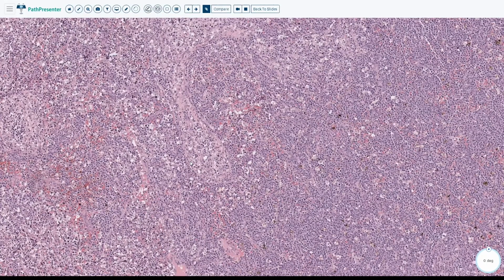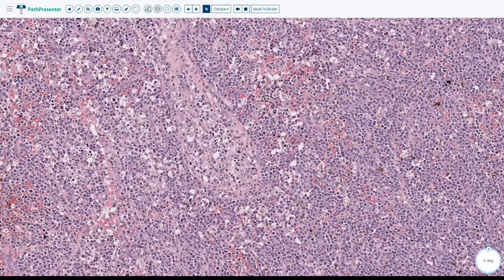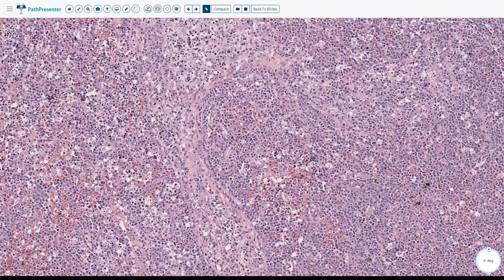It's kind of doing it here. You might have to use your imagination a little bit. So even though there's some effacement of this tubule, what we can see here is we have layering of these tumoral cells going around the tubule. And you could imagine that if you follow these all around, they impart this sort of concentric ring or an onion skinning type appearance, which is what this lesion is known for.